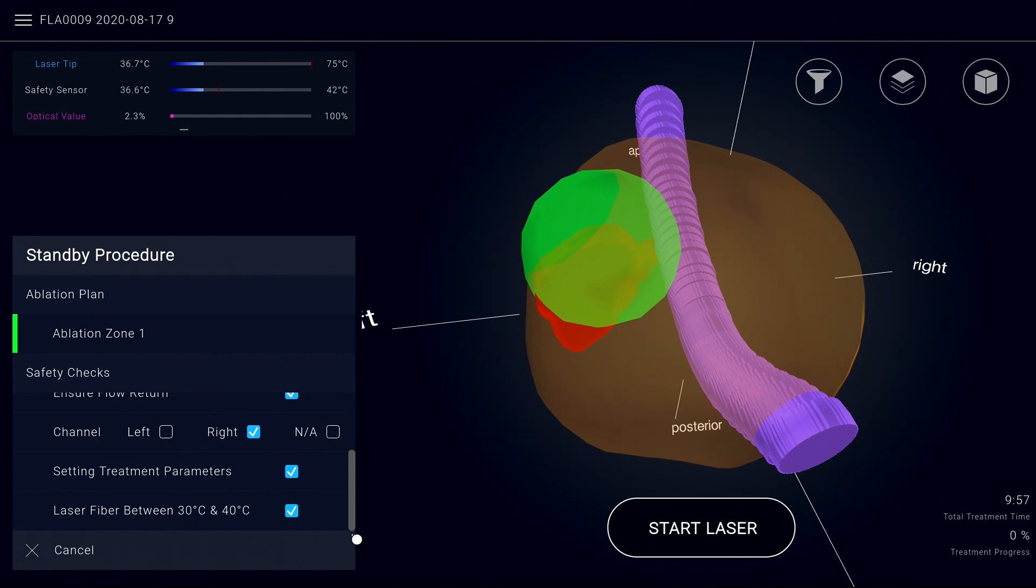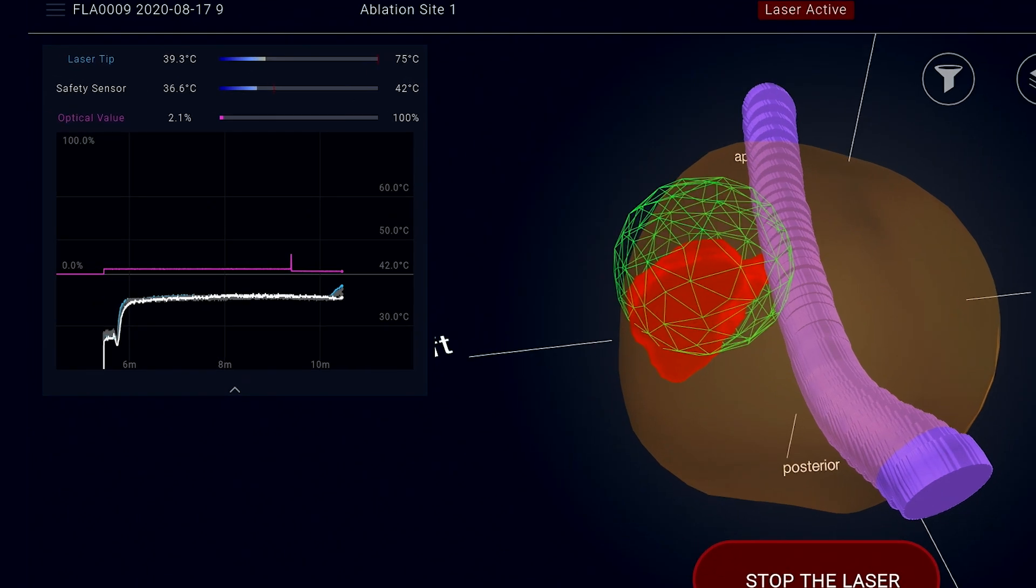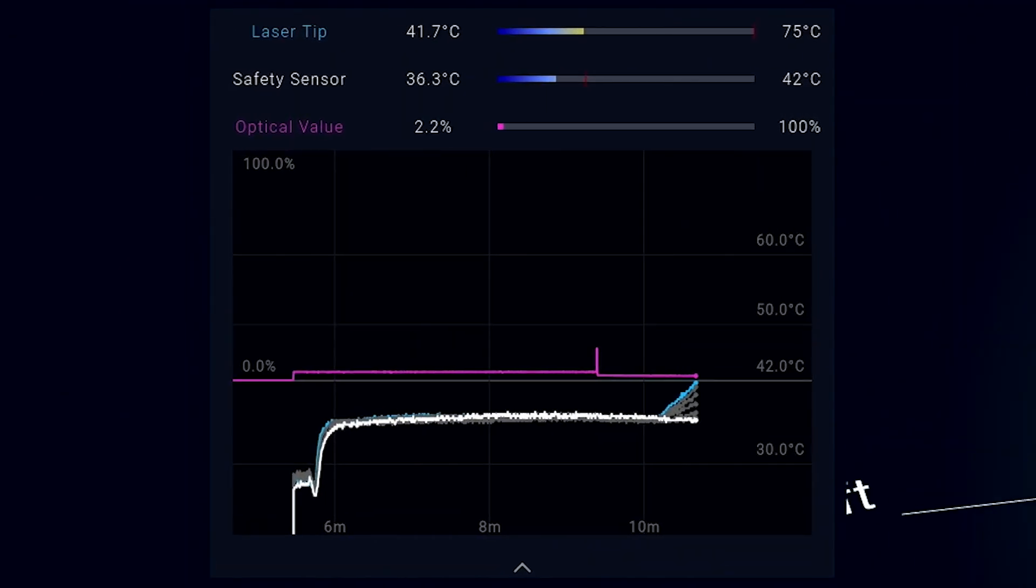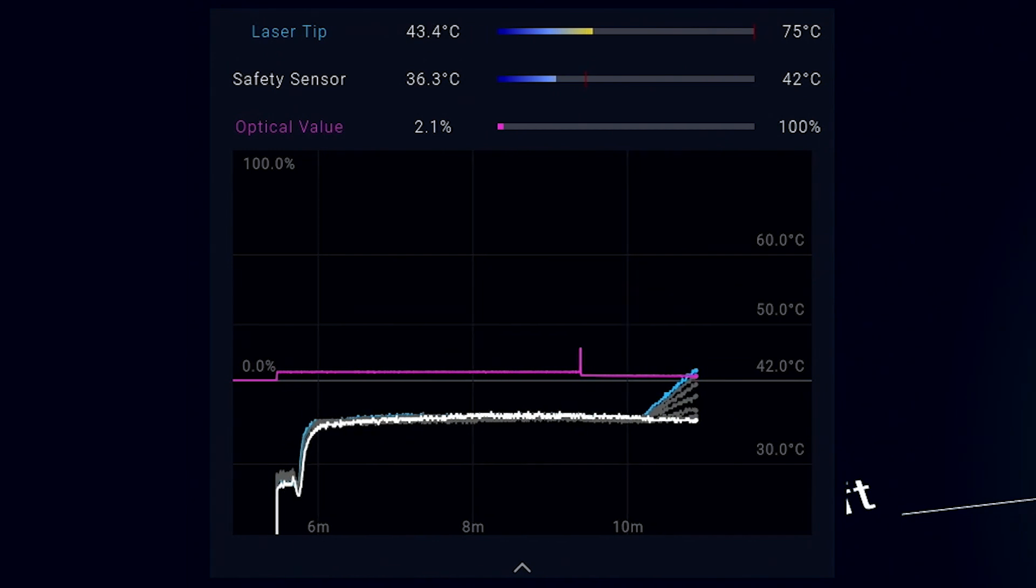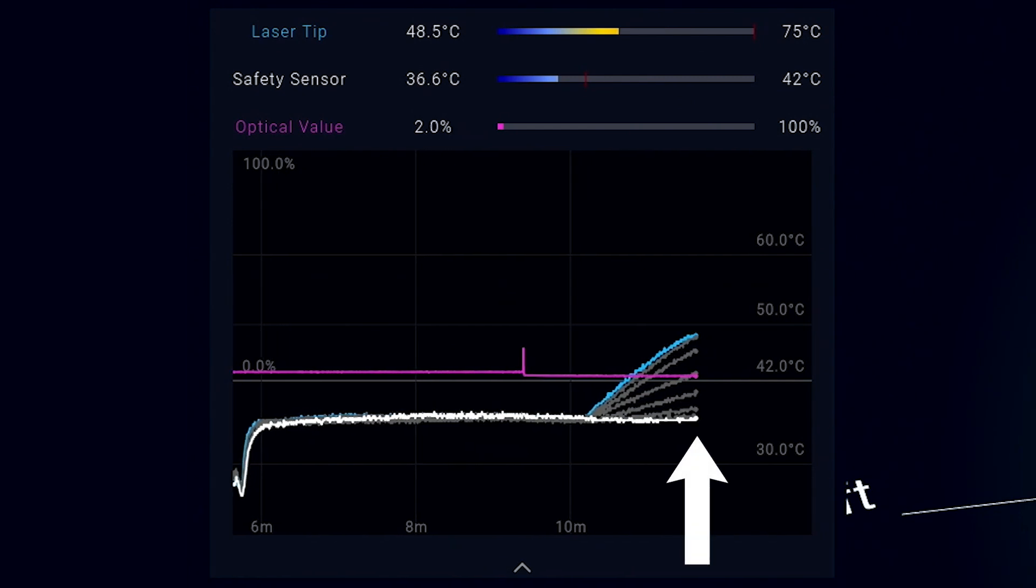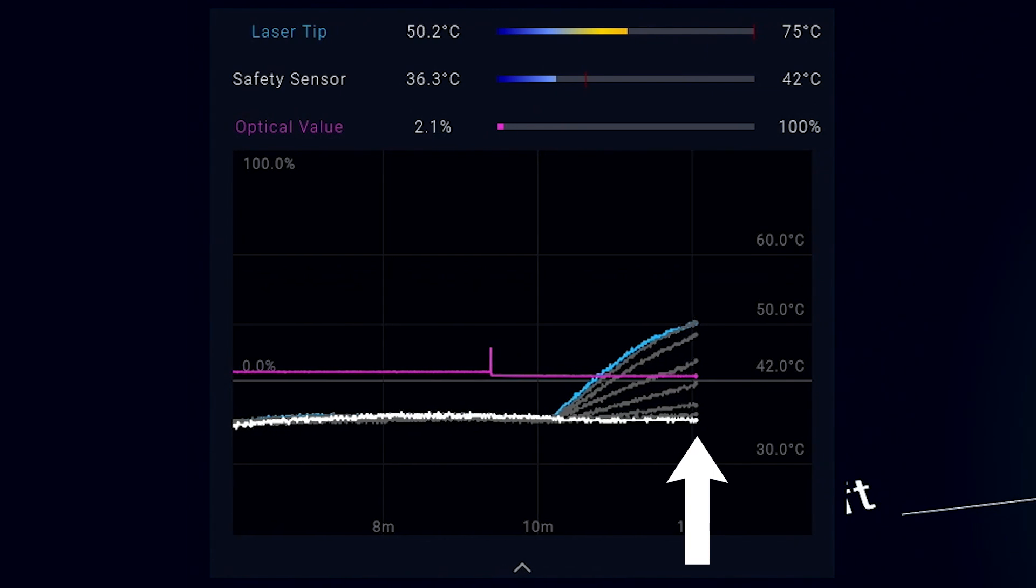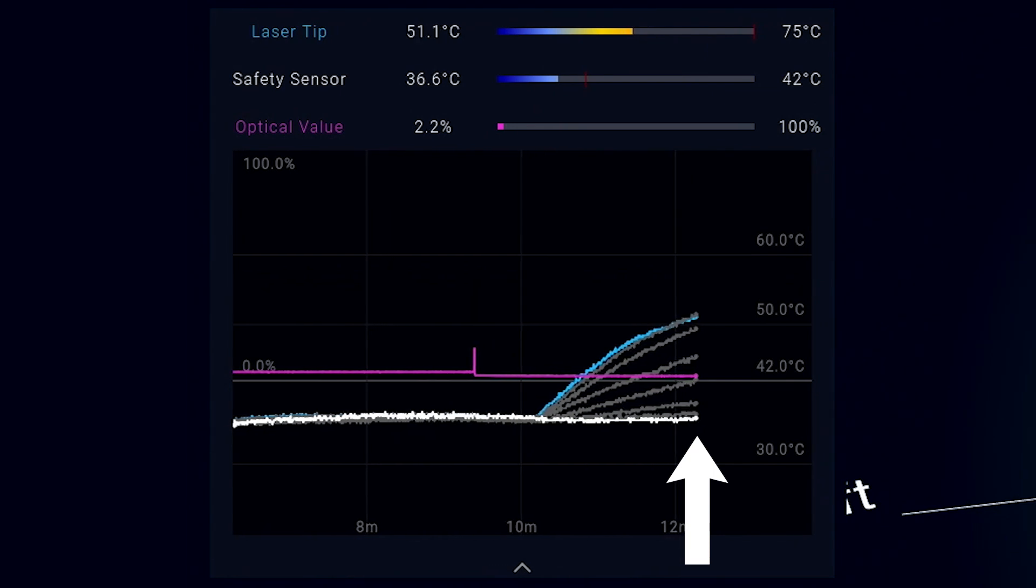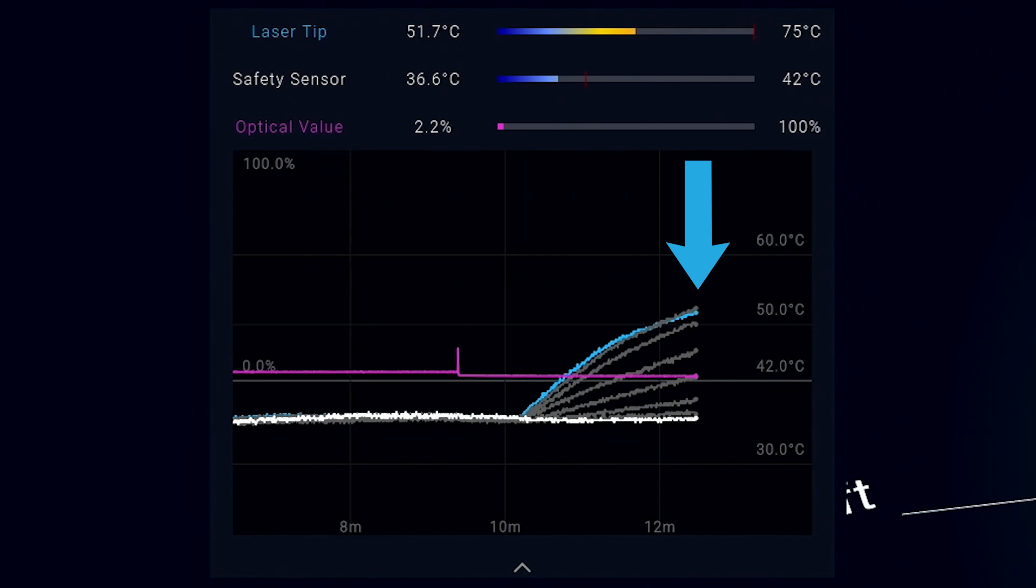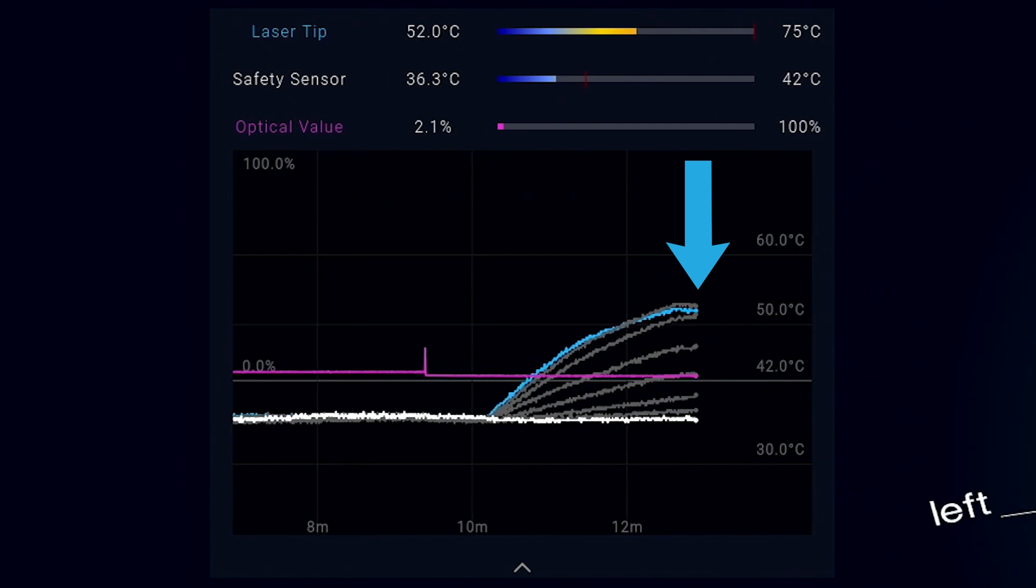Once the safety checklist is complete, the operator may then press the start laser button. Temperature recordings will appear on the left side of the screen that evaluate multiple thermocouple positions within the thermal probe. The thermocouple closest to the rectum is displayed as a white line. This temperature should not exceed 42 degrees and will trigger an automatic stop if this temperature is reached. The thermocouple closest to the laser tip is marked in blue and will gradually increase temperature after laser activation.